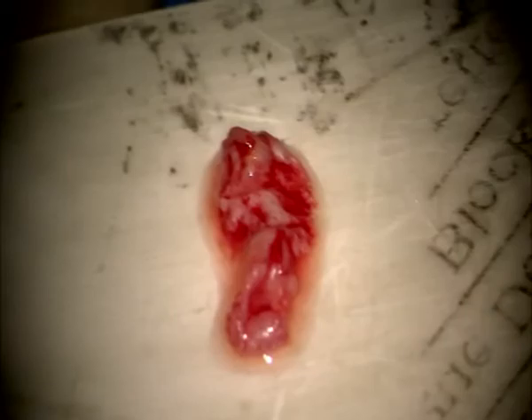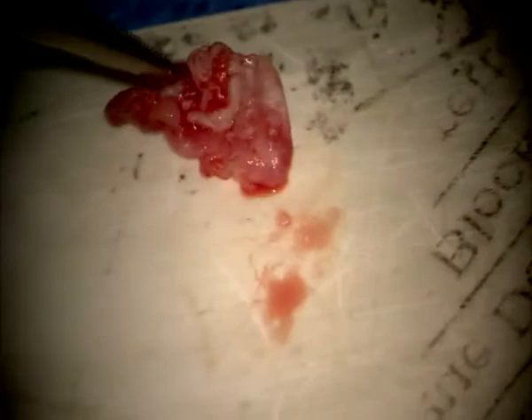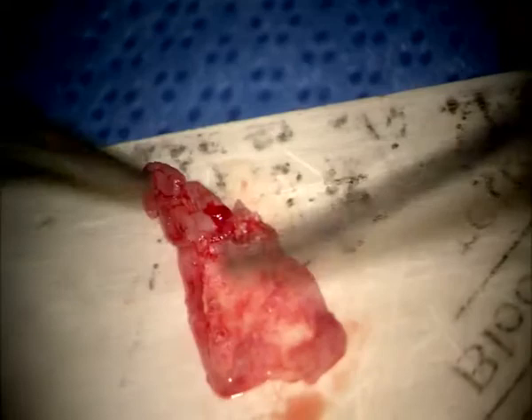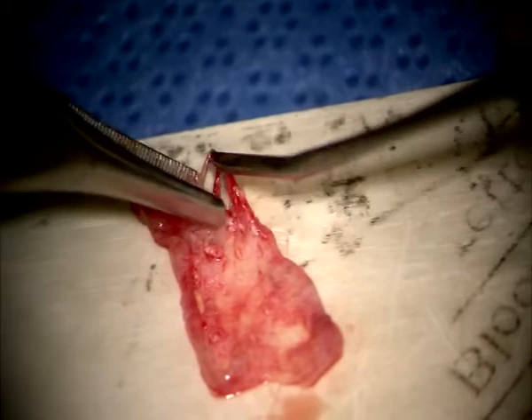Give me a sponge. So this is the skin that we took out. Give me an Adson and a house. Most important issue here is to know where is the epithelium and where is the other side. You don't want to put it the wrong side in. So we're going to place this back in the ear canal as a free graft. Give me a scissors.